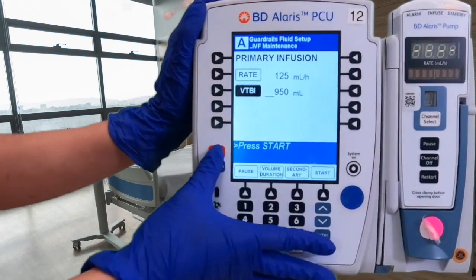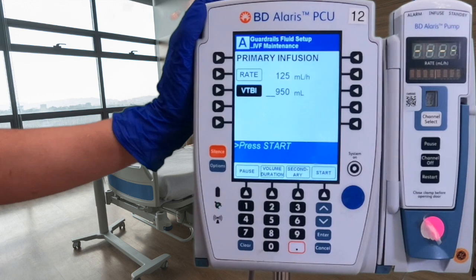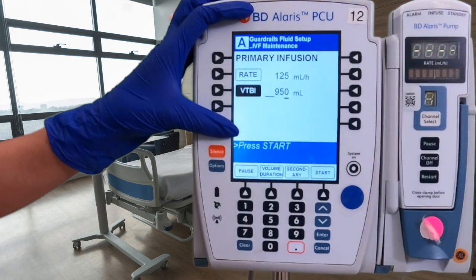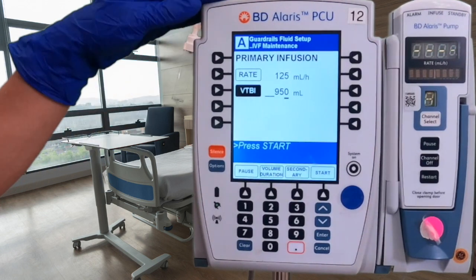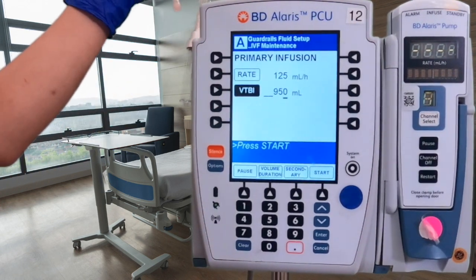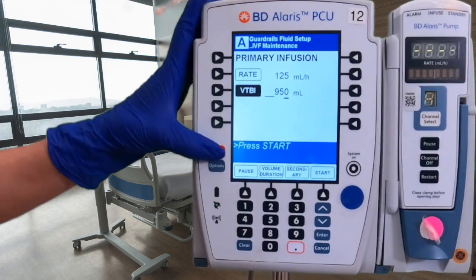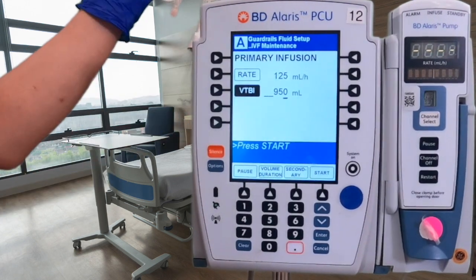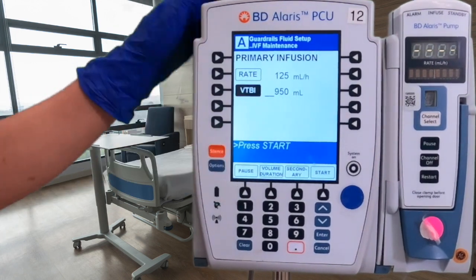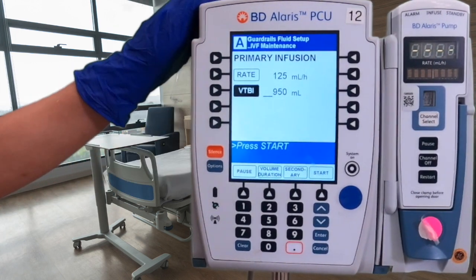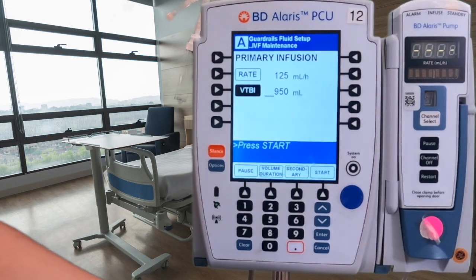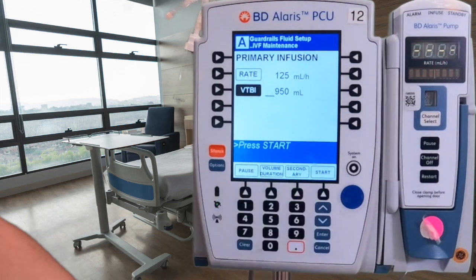Once all of that is set, double-check your orders one more time to confirm: 125 mL/hr, sodium chloride bag, and volume to be infused is 950 mL. Once you are confident everything is correct, unclamp the patient line and then press start.